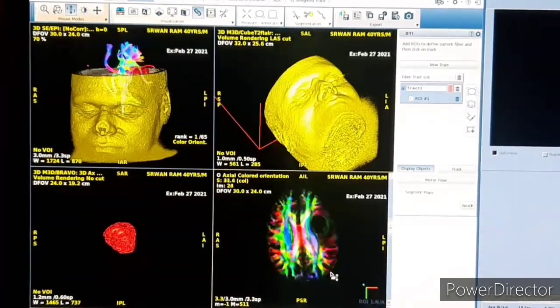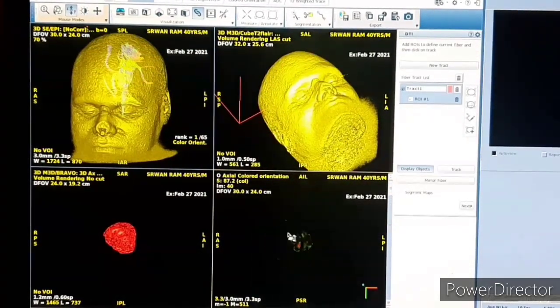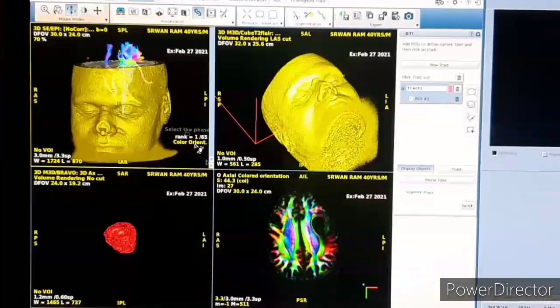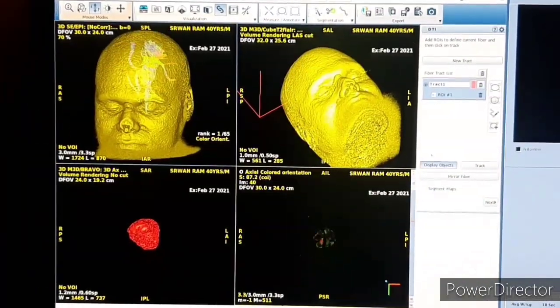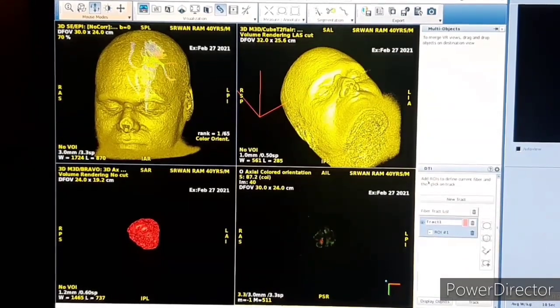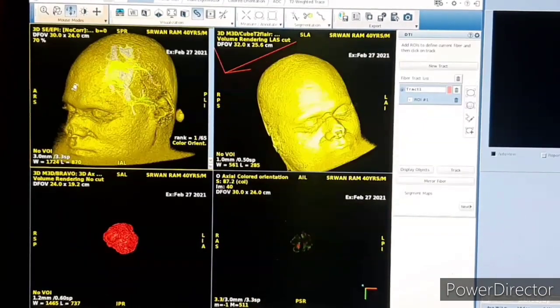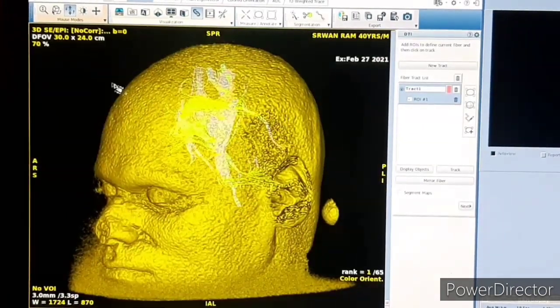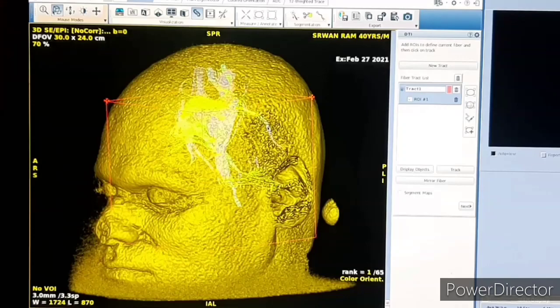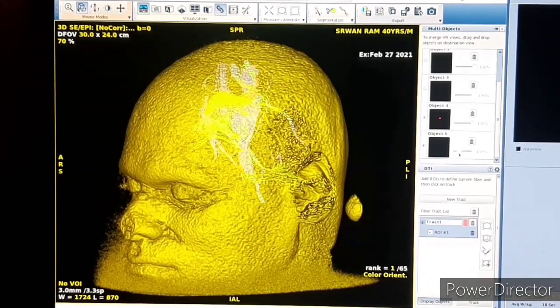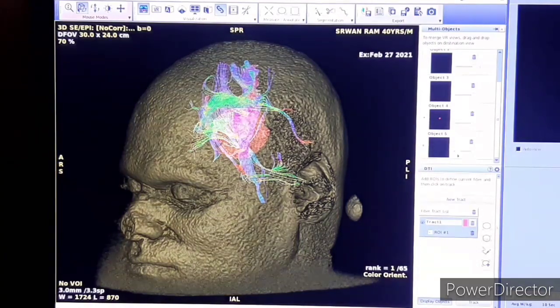DTI tractography is an MRI technique that measures the rate of water diffusion between cells to understand and create a map of the body's internal structure. It is most commonly used for imaging of the brain. You can see this very nice 3D DTI tractography result.